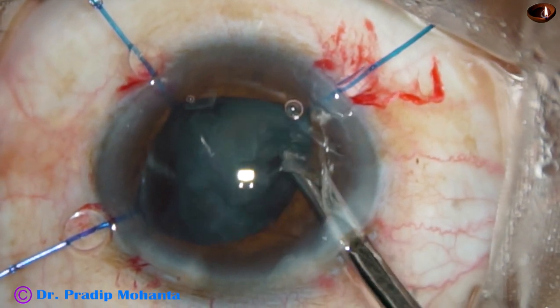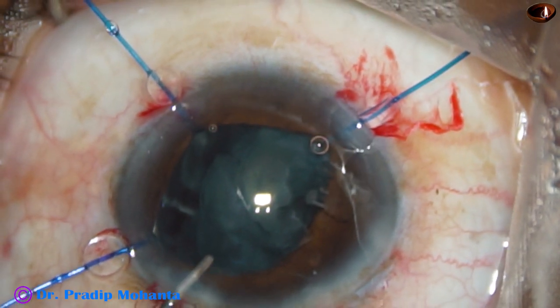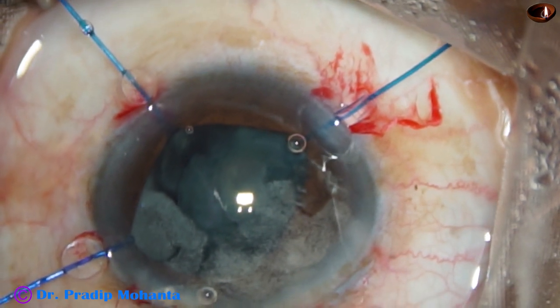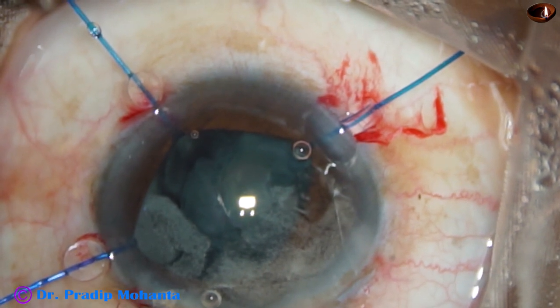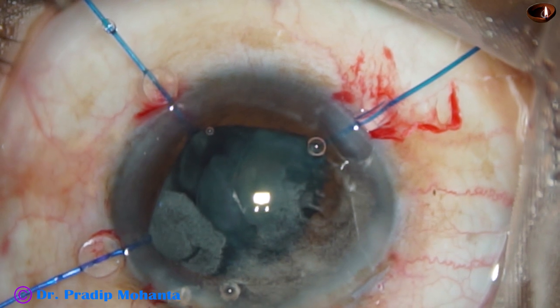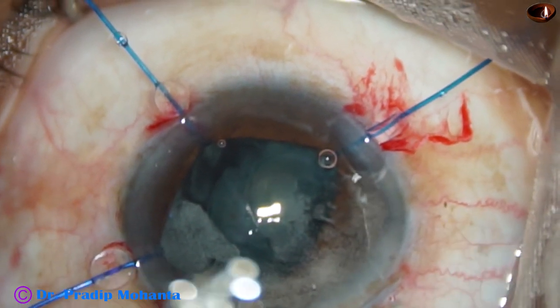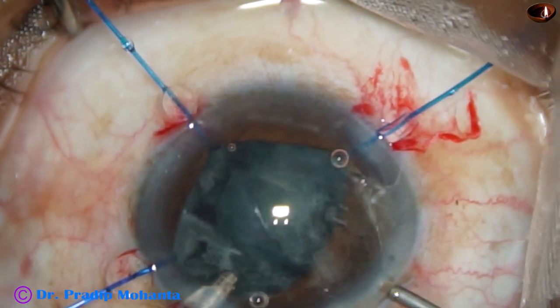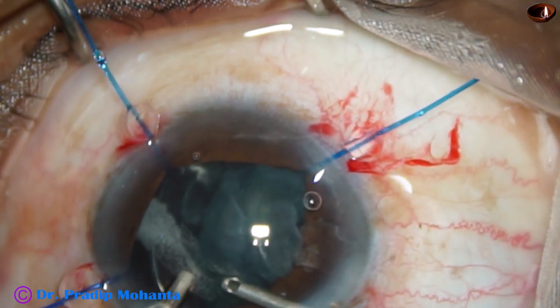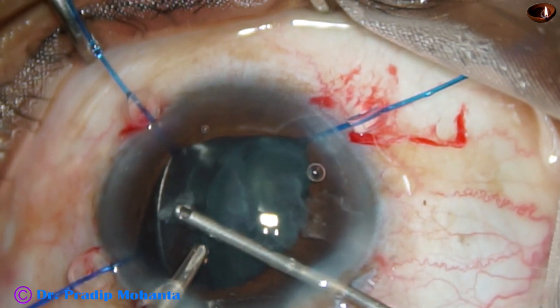I should probably have hooked the rhexis margin. Since the vitreous has come, I inject some more triamcinolone acetate and use the cutter again — the 23-gauge cutter. Sometimes we have to give time to our assistants. We cannot be impatient. For this kind of surgery needs cooperation of everybody.